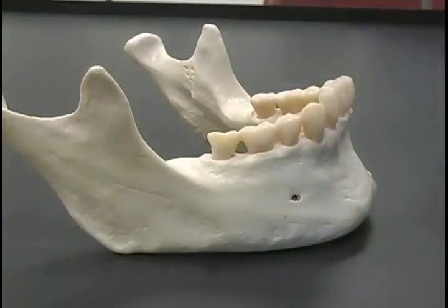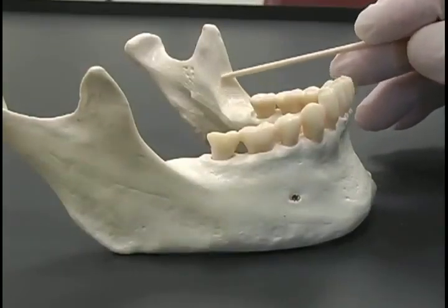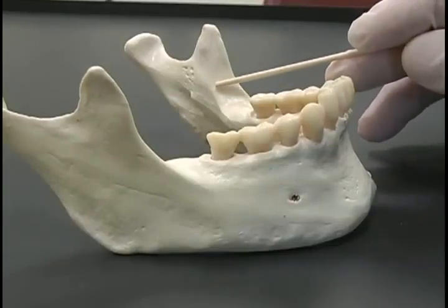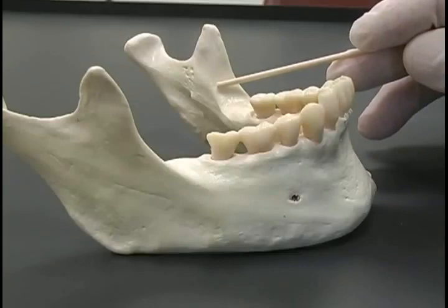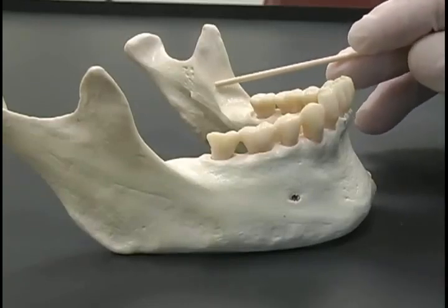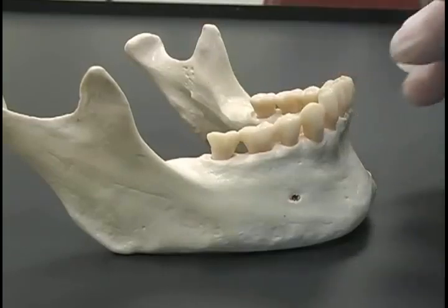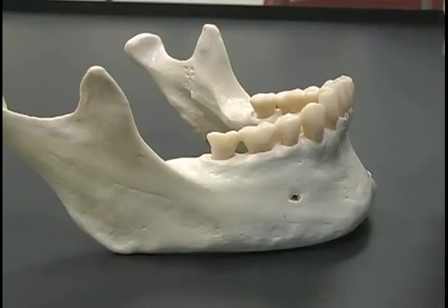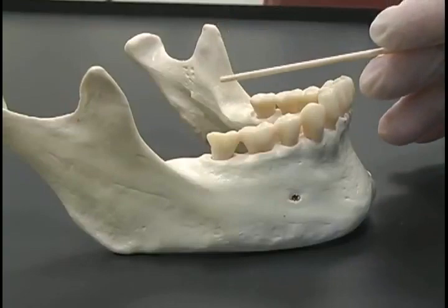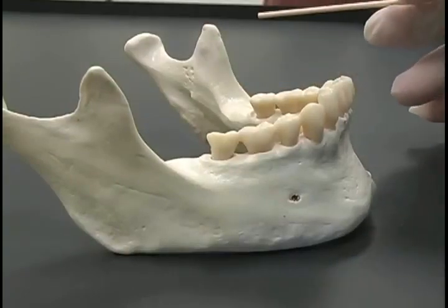This technique means that there is more manipulation in the area where bony contact is reached, but the main advantage of the indirect technique is that the anatomical location is more secure because the contour of the bone is followed more closely. When using the pterygomandibular raphé as the only anatomical landmark, and this landmark is missed, the location of the anesthetic is much more uncertain.